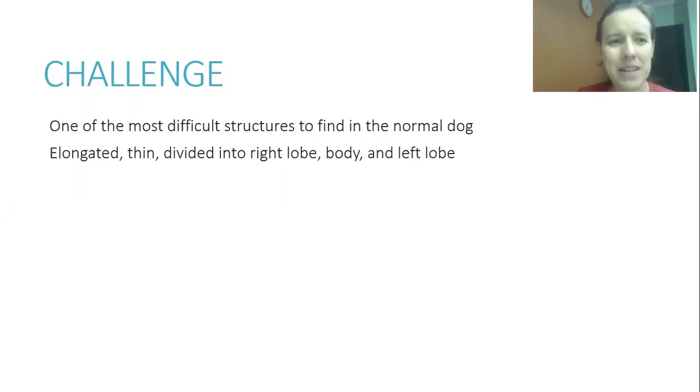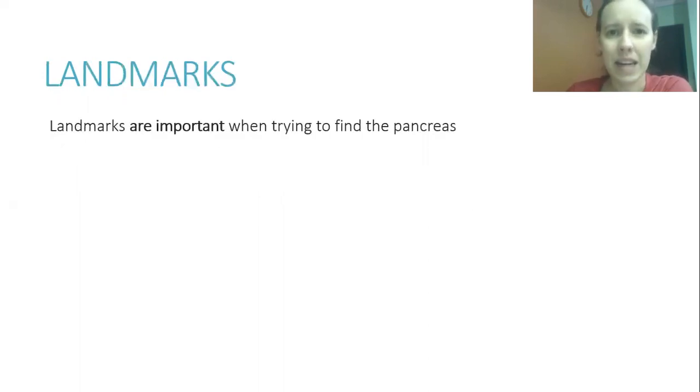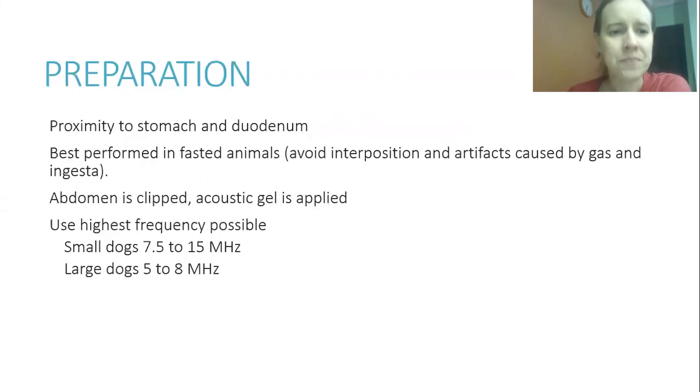The pancreas is an elongated and thin organ, divided into the right lobe, body, and left lobe. Landmarks are very important when trying to find it. If you don't see the pancreas, at least ensure you evaluated all the landmark areas. Ideally, you should see and measure it in all your exams. Since it is very close to the stomach and duodenum, the animal should be fasted to avoid gas and food artifacts.